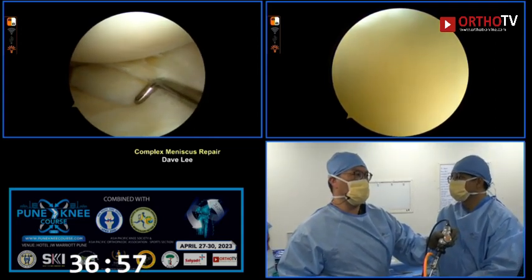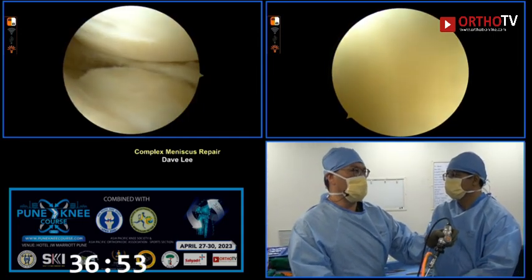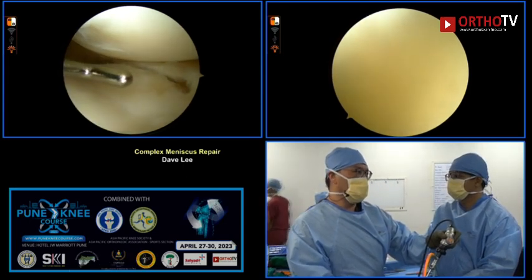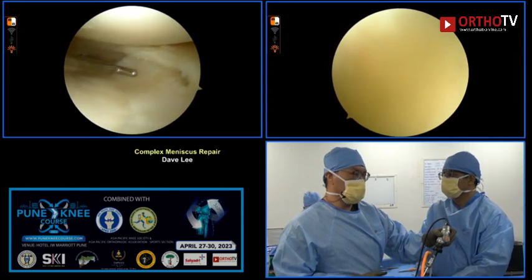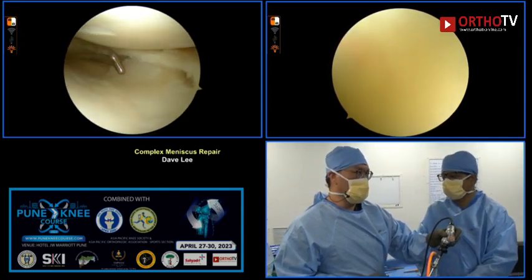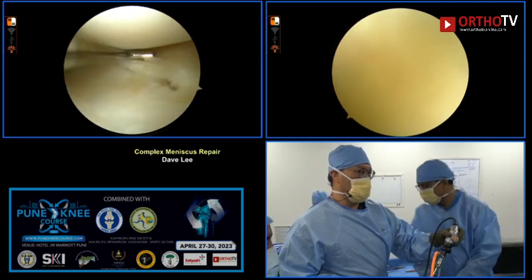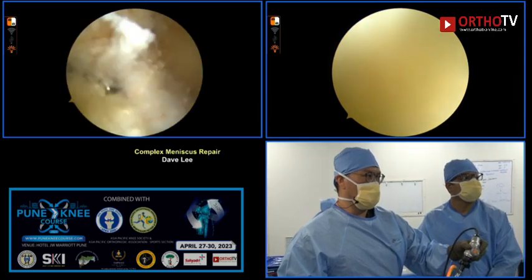So Andy, should I fix it or remove it? I saw what you did. Okay. Truth is, I would probably take it out. But I think that she is 30 plus, it's a long flap, and so I decided to repair it.